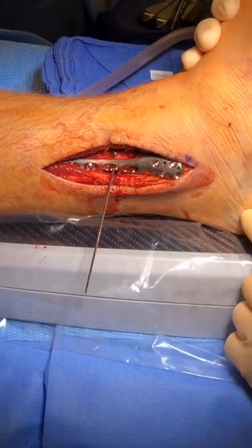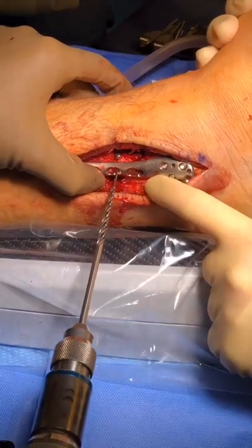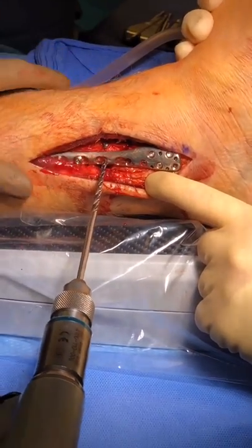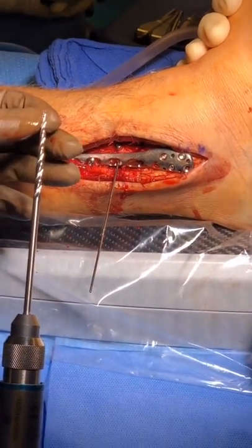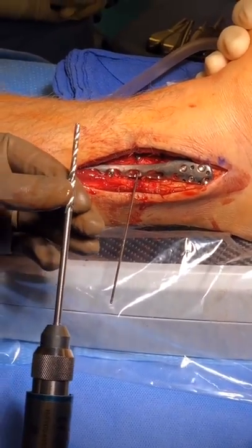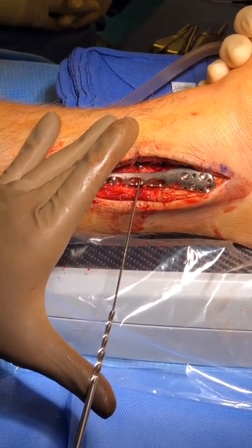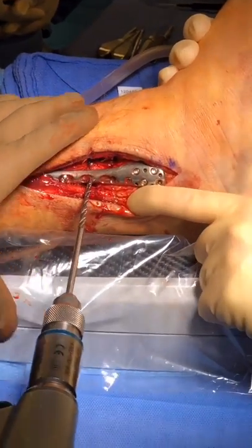This is the step drill, and we'll slide this over the wire, and we will drill both the tibia and fibula. It's important that we only place the larger diameter portion of the step drill through the fibula, and fluoroscopy is important to confirm that this is done correctly.